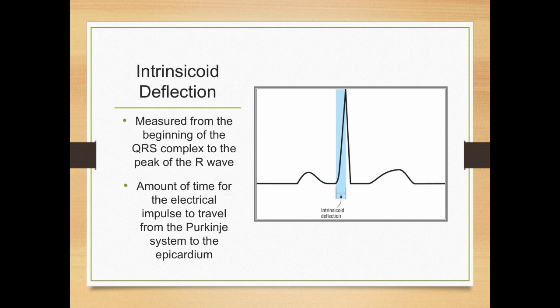we can measure the intrinsicoid deflection, which is really cool and a really fun word to say anyway. So I'm going to say it again. Intrinsicoid deflection. It's really fun. Try it out at a party. No one will like you.